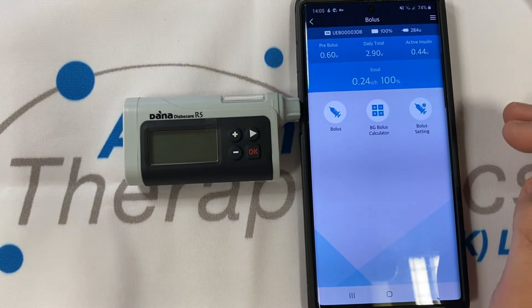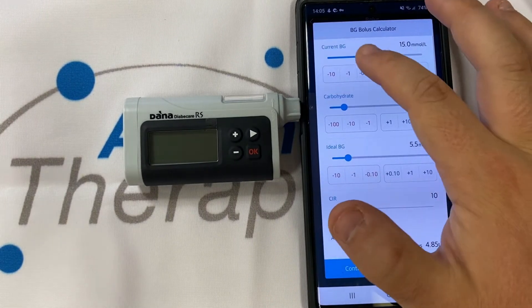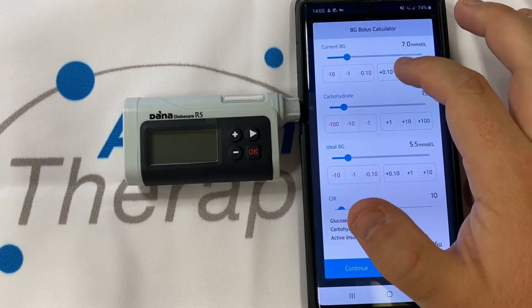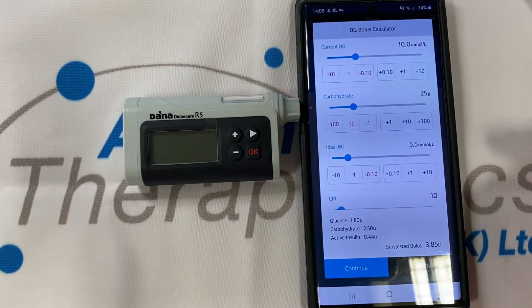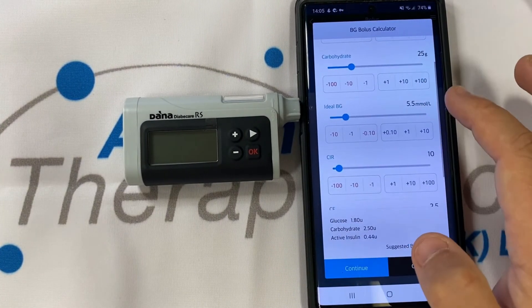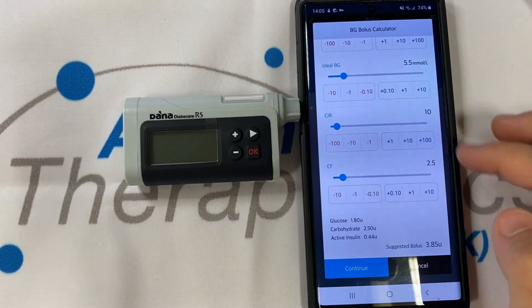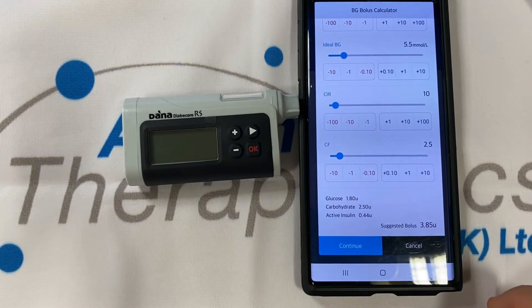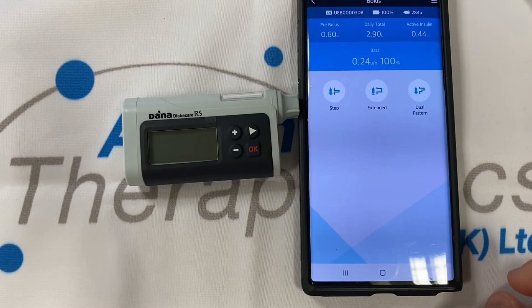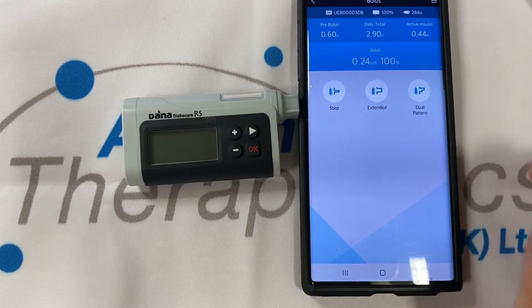Bolusing has never been easier. Just tapping on bolus, accessing the calculator, dialing in your blood glucose result, programming in your carbohydrate amount. You may manipulate your target blood glucose if you wish and here you can check or change your ratios. The suggestion is built for you at the bottom of the screen. We can choose our three different methods of bolusing: step, extended or dual pattern.